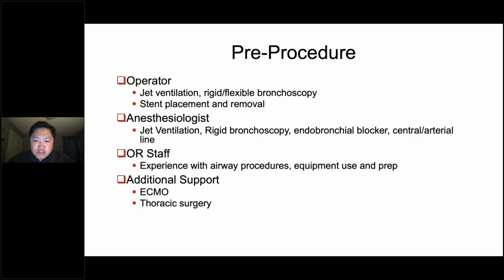And we've had thoracic surgery on board as well, just in case. I can remember a case where we were removing a stent that was placed in an outside facility that was left in there for close to 18 months, and it was really difficult to remove. So having a lot of people on board to help is a benefit.